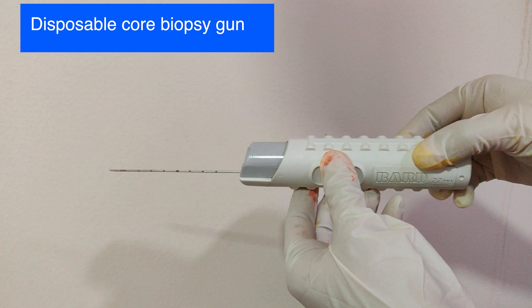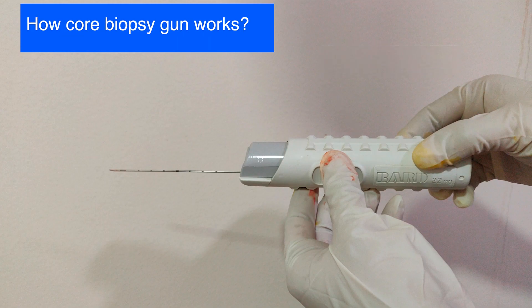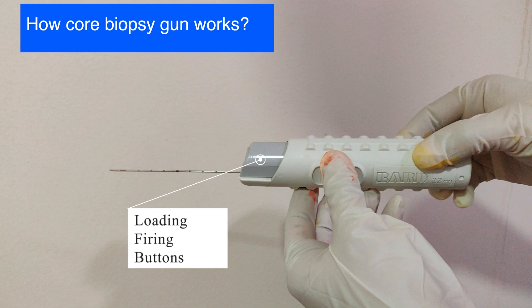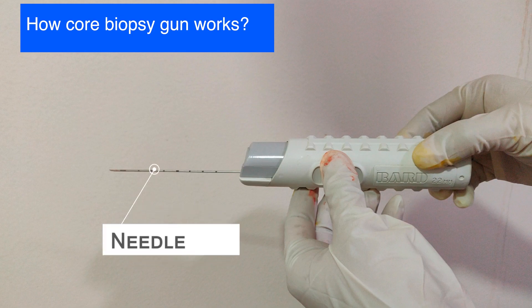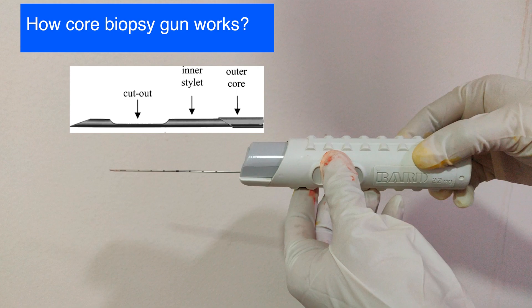This is a disposable core biopsy gun. It has a housing unit which contains the loading buttons and the firing buttons, and there is a needle. This needle contains an inside stylet that has a sample notch in which the core biopsy is collected, and there is an outer cutting cannula.